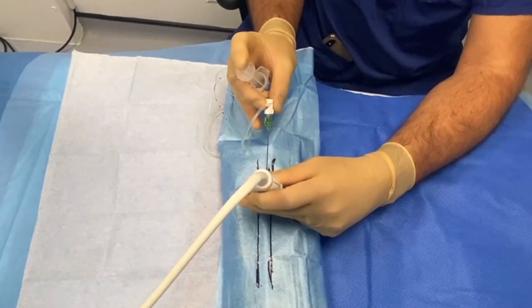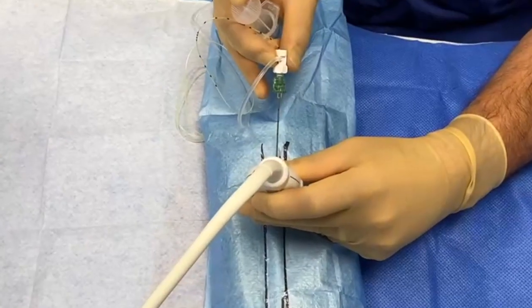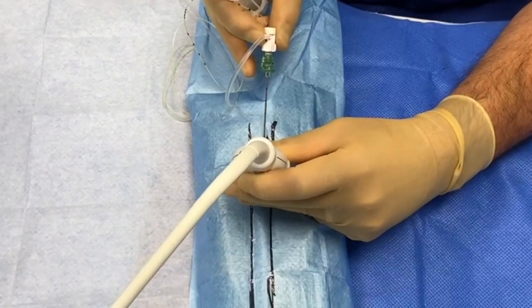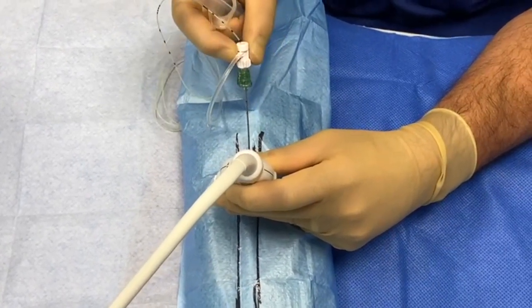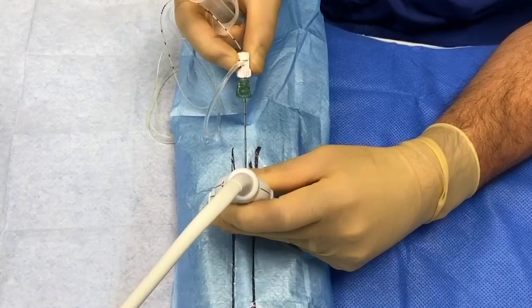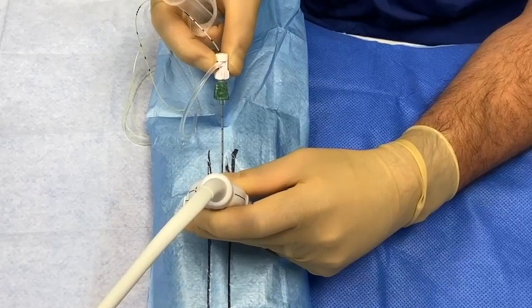Now this is mimicking a patient in the prone position, scanning at the back of the leg, doing an out-of-plane technique. I've got the probe here, getting across the popliteal fossa and found a nice place where I can see the nerve. I've popped through into the sheath, injected some saline, and I've actually got a nice view of the needle within that sheath between the tibial nerve and the common peroneal nerve.